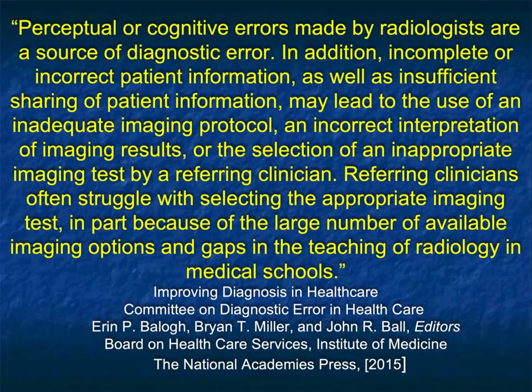When you think about radiologists specifically, this issue was addressed, that perceptual or cognitive errors are made by radiologists. In addition, incomplete or incorrect patient information, as well as insufficient sharing of patient info. For example, we don't have old films because it was done in another hospital. There's no central data storage. This lack of information may lead to the use of inadequate protocols, incorrect interpretation of results, or selection of an inappropriate imaging test by a referring physician.